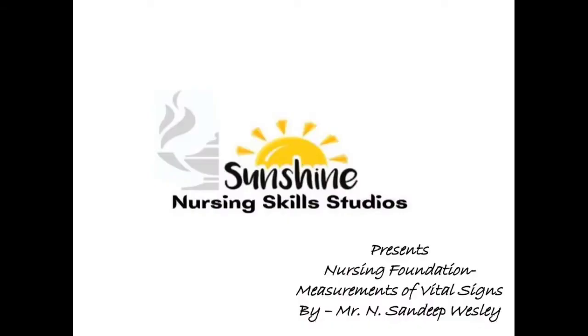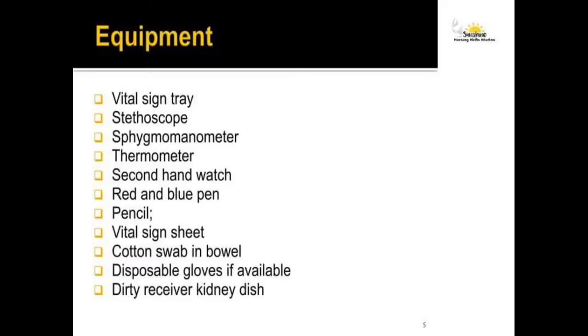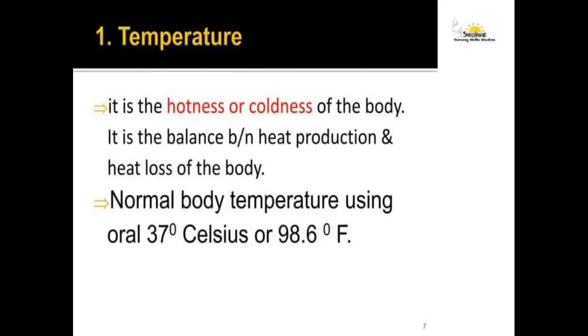Measurement of vital signs is a very important skill that every nurse needs to apply in her professional life. Let us start with the equipment that we need to keep ready before we go to a patient to check the vital signs. So these are the equipment. And let's begin with the temperature. So firstly, let us know about the temperature.